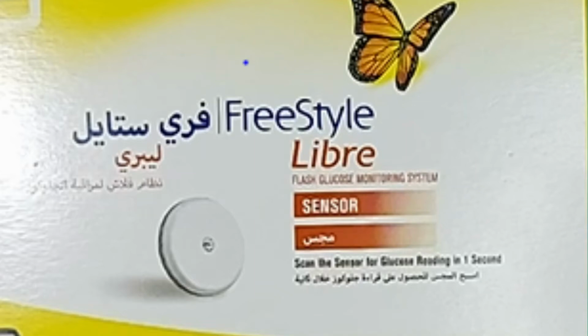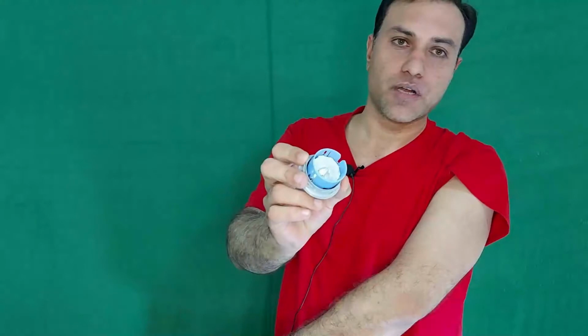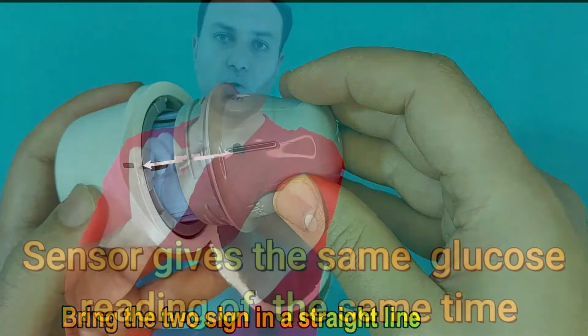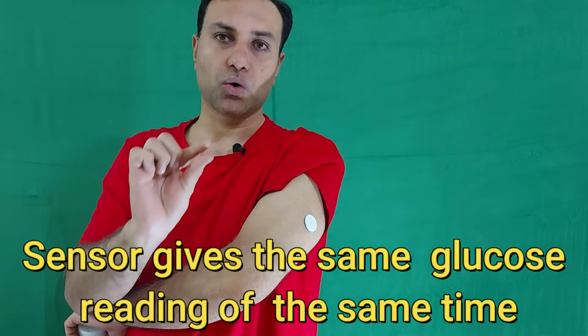Freestyle Libre sensor, how to apply on the back of the arm. I will show you in this video in detail how to assemble the Freestyle Libre sensor and how to apply it on the skin, and what is the mechanism of the Freestyle Libre sensor. Please watch the video until the end.